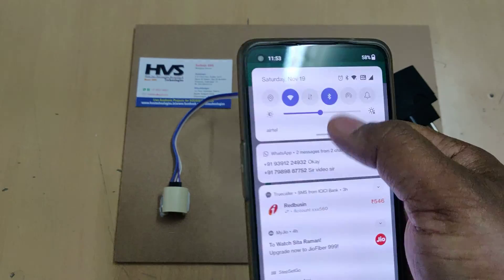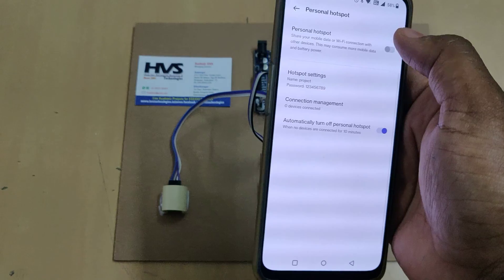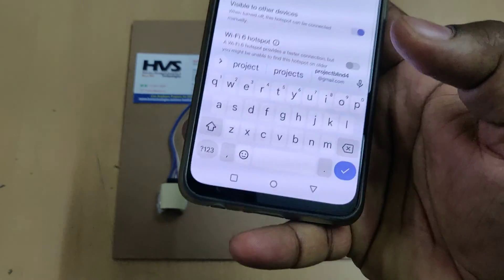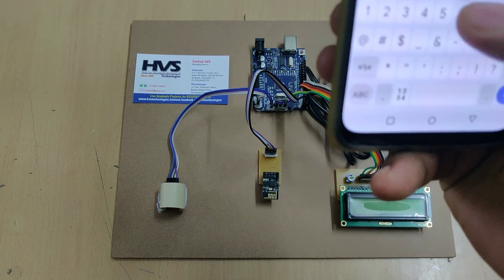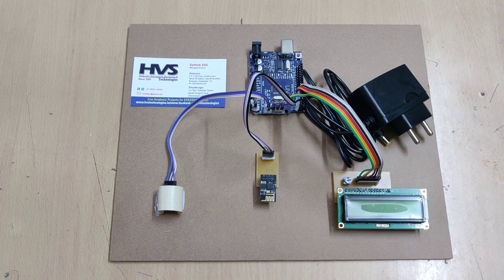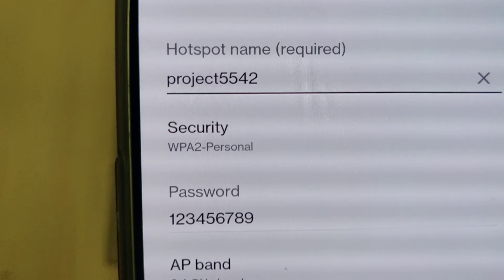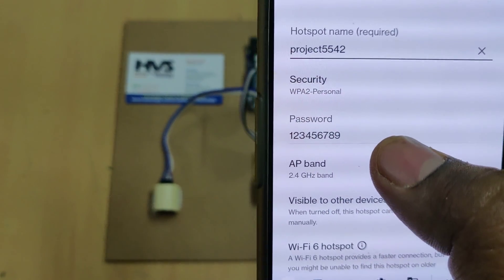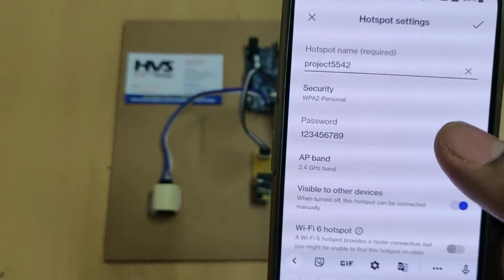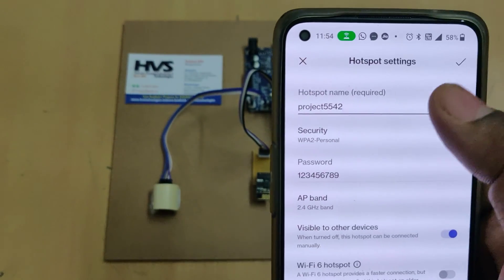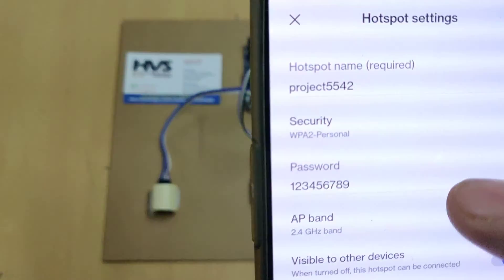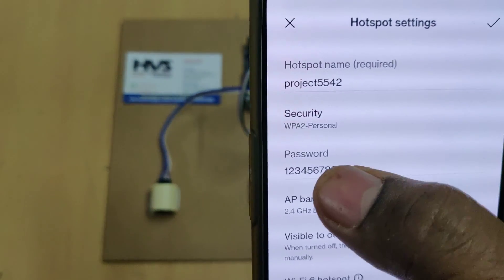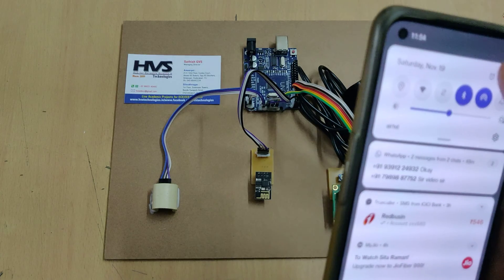Before switching on, the first thing is to enable the hotspot on your phone. Go to hotspot settings on your Android mobile phone and change the hotspot name to 'project5542' — no spaces, no capital letters. The password should be '123456789' and the frequency should be 2.4 GHz. Check these settings twice before turning on the hotspot.